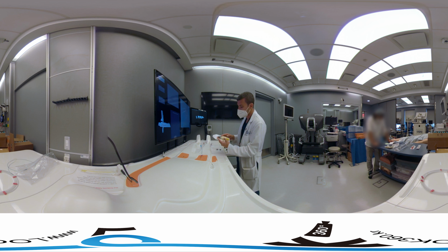So I wanted to give you an example of those particles that we're using. These are the 100 to 300 particles, and you can see here that they lay in suspension in solution. What you do is you combine this with contrast, and that gives you your embolic that you use here in this chemoembolization procedure. Now this is usually mixed, and usually this red color when it's mixed with doxorubicin or some other kind of chemotherapy agent.